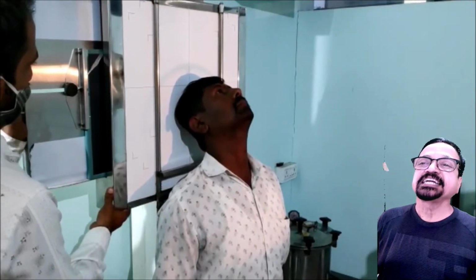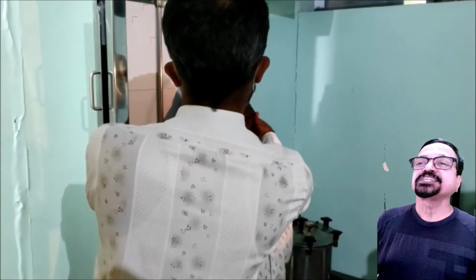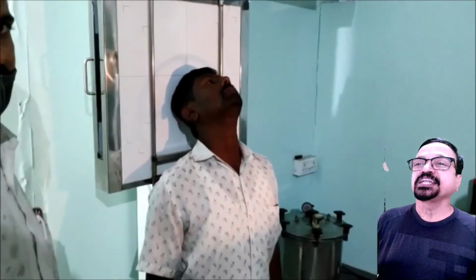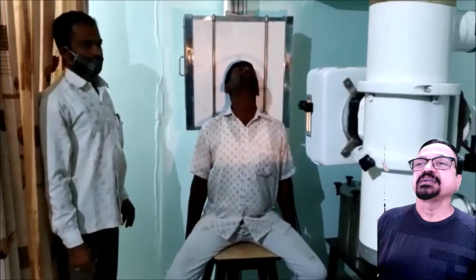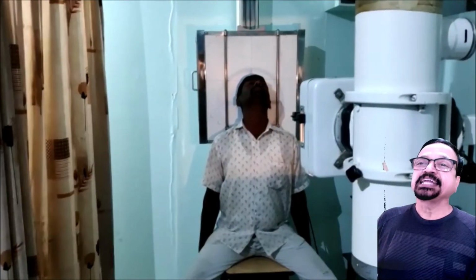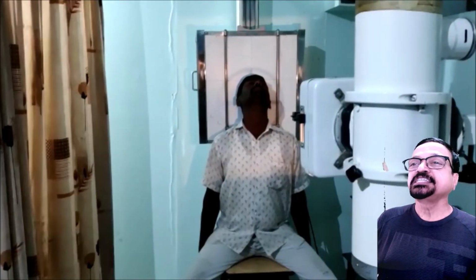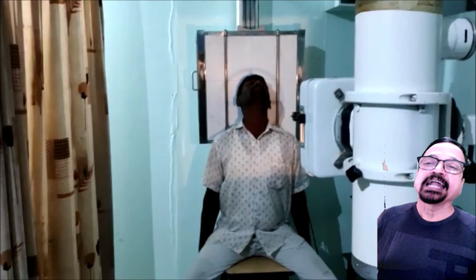Now the cassette is adjusted, the neck is hyperextended, again it is checked for rotation, so there is no rotation. So let's go for the exposure proper. Yes, it is correct. From the center it is seen, both ears are seen. The best part of this view again is the zygomatic process. It should be seen as symmetrical on either side, like the handle of a jug.